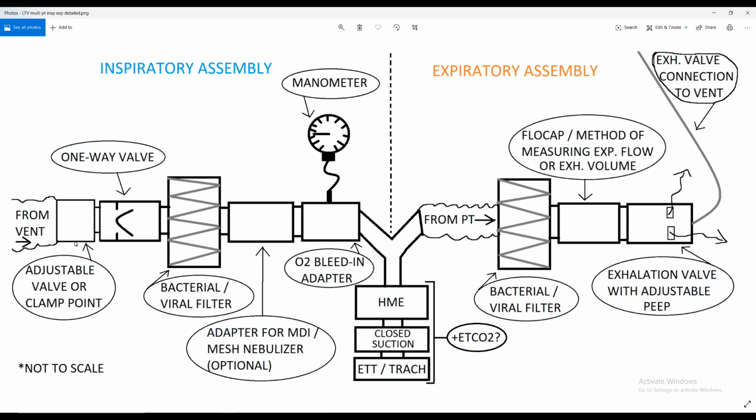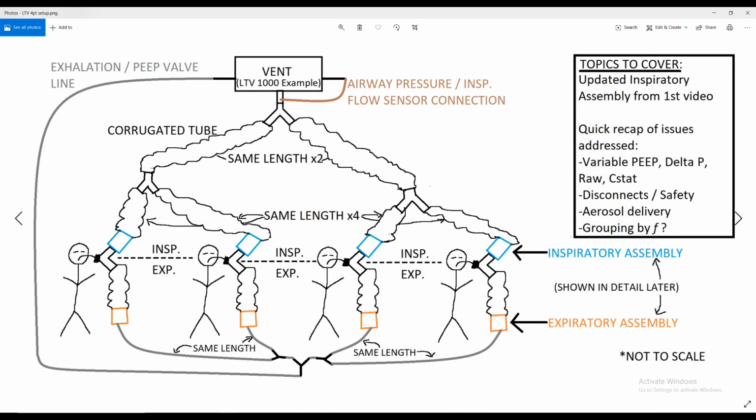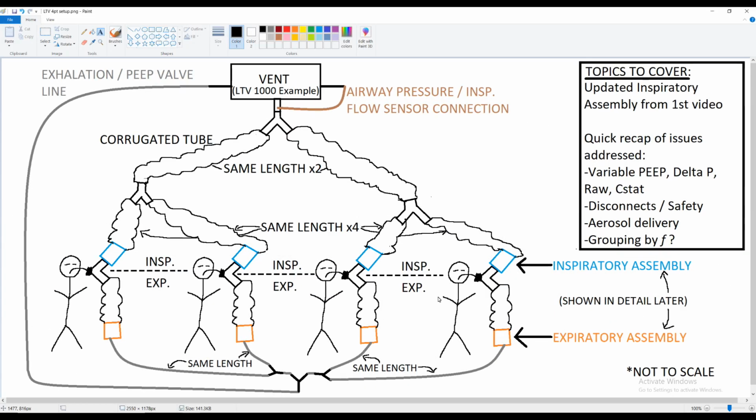So let's see what that actually does for us. Let's translate this setup right here to the grand setup. So where did I put it? Here we go. Okay, I wanted to have it in Paint actually. Okay, so taking that updated inspiratory setup, or inspiratory assembly, we crossed that off our list. That's what we're using right here. Expiratory assembly stayed the same and everything. Of course, all same lengths and different generations of tubing, everything I mentioned in the previous video.